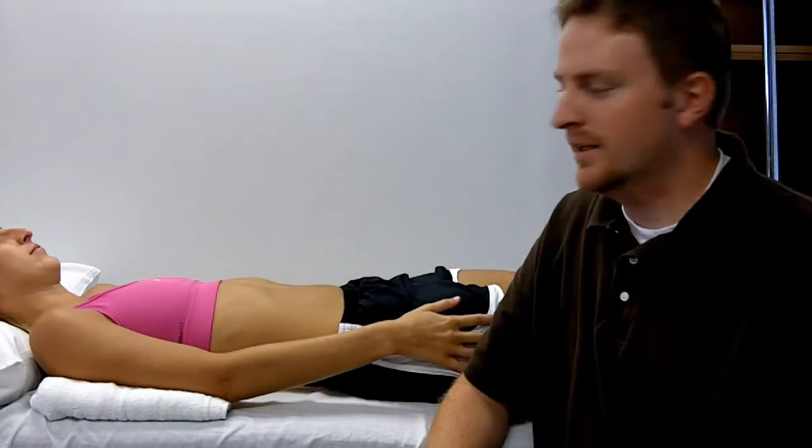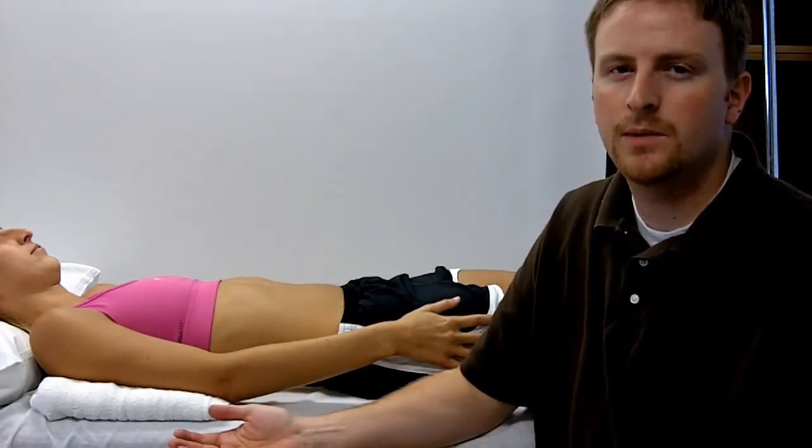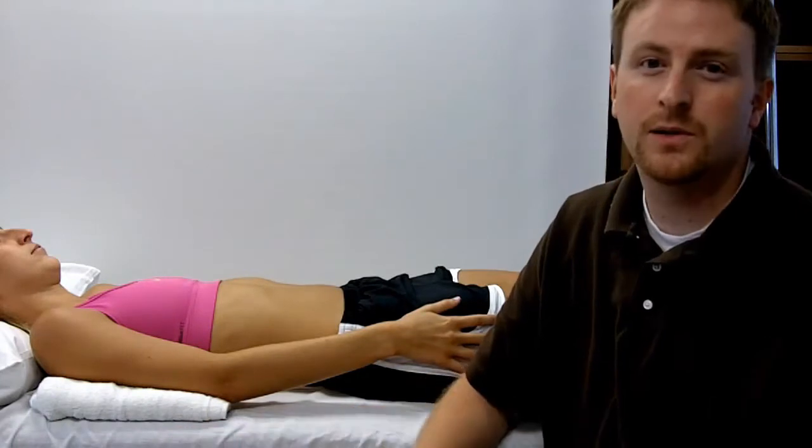To assess elbow flexion and extension, you're going to ask the patient to lay in supine, keeping in mind that your patient may not be able to tolerate this position. You can also measure it in sitting.